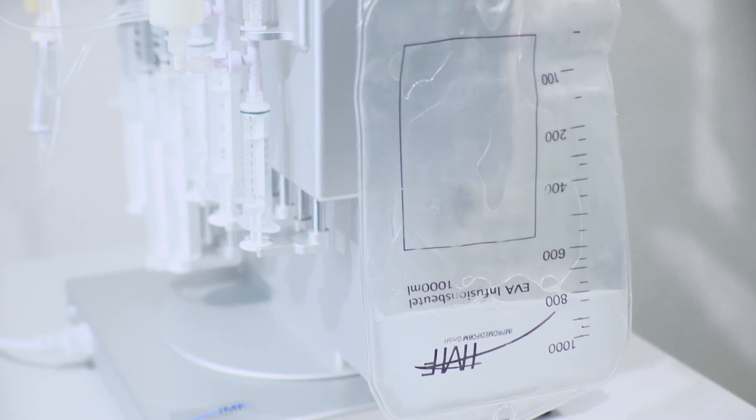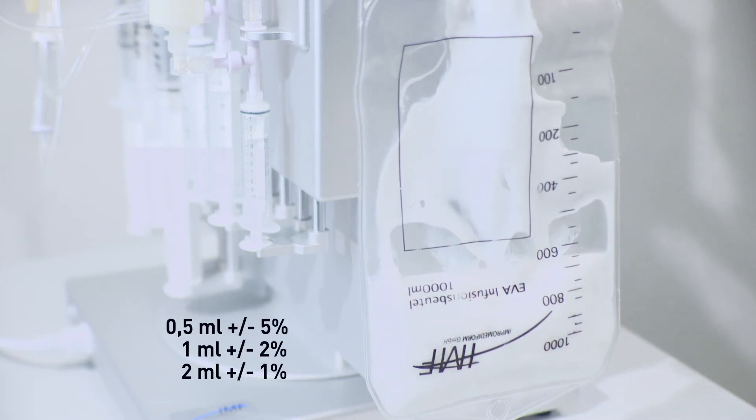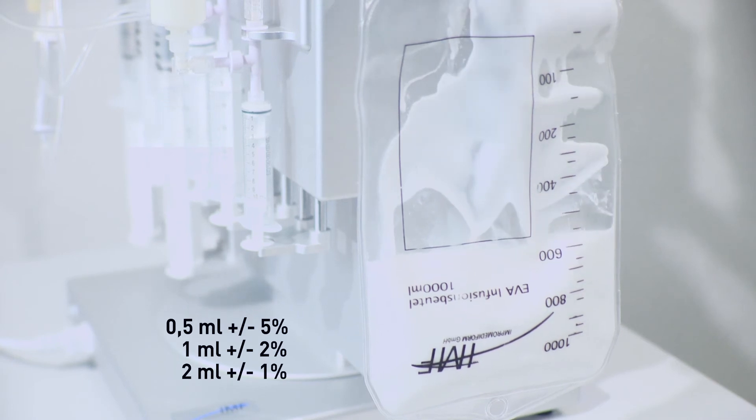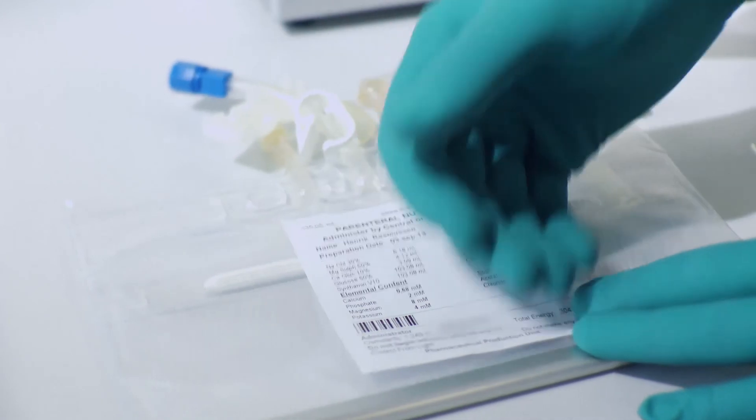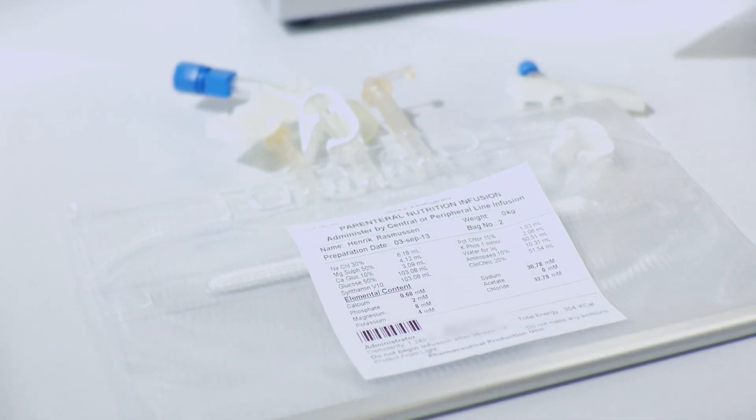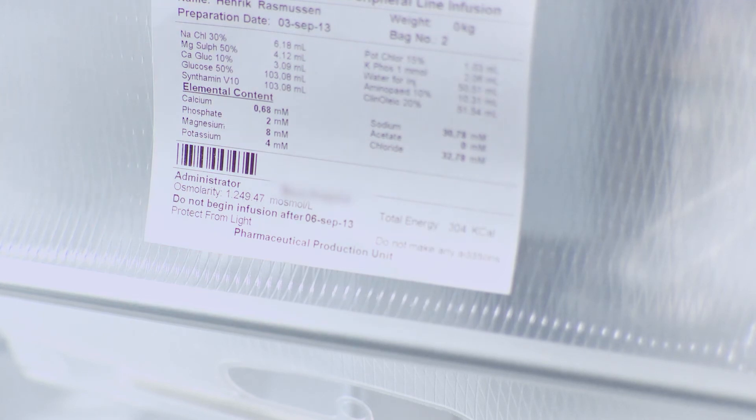The system pumps suggested volumes as low as 0.5 milliliters with a variation of 5%. The barcode technology can also be used for the selection of patient files by scanning the label barcode. This will ensure the proper formula is pumped for each patient.